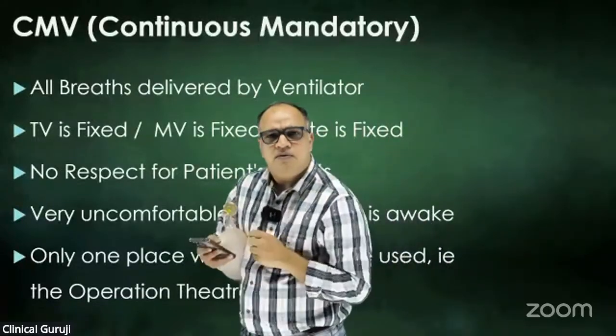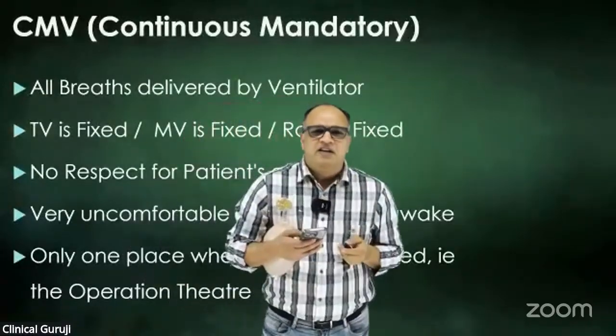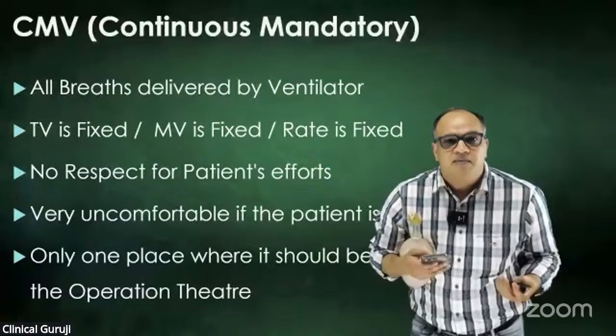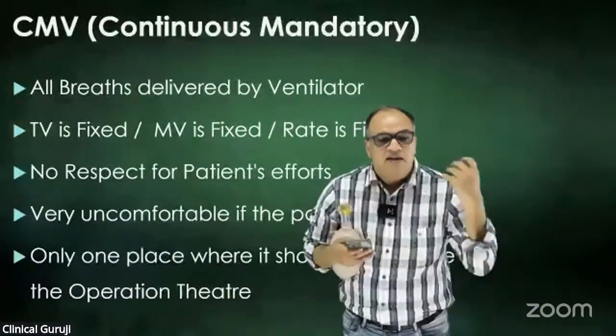So far so good. Right. So now Ramadhir Singh was very unhappy with perpendicular. That okay, fine, the patient is breathing, he's alive, but he's very uncomfortable. He's going into hypotension because there is gross patient ventilator dyssynchrony. Perpendicular was called again. You ventilated wrongly.